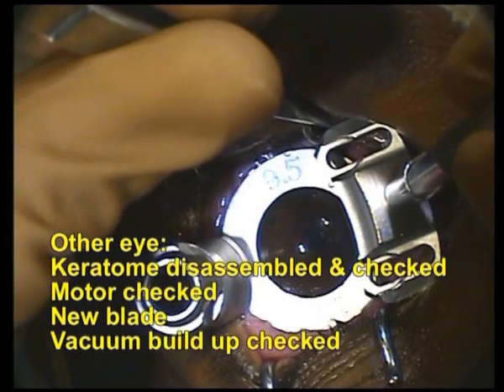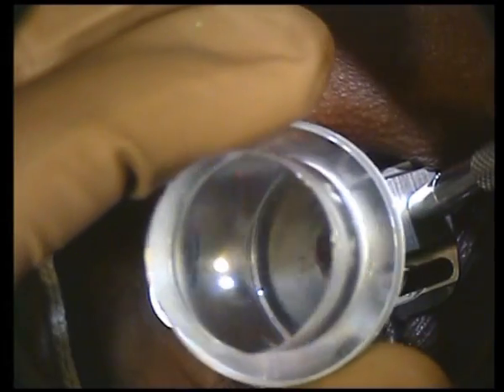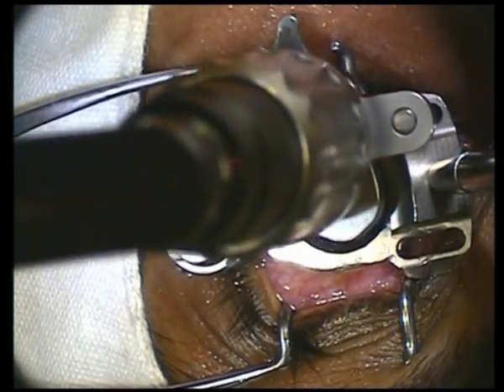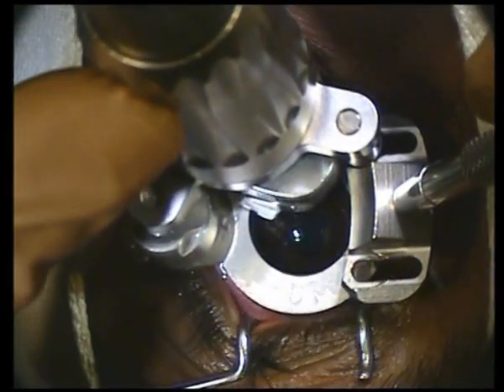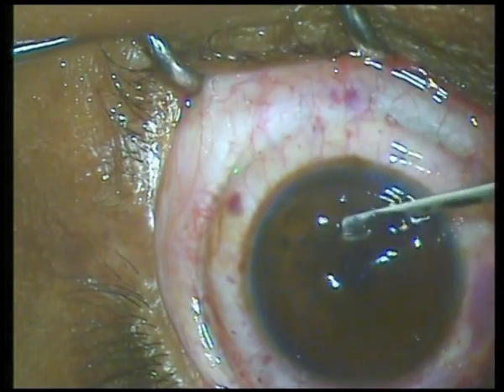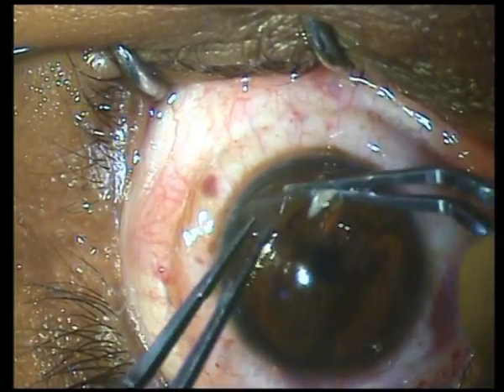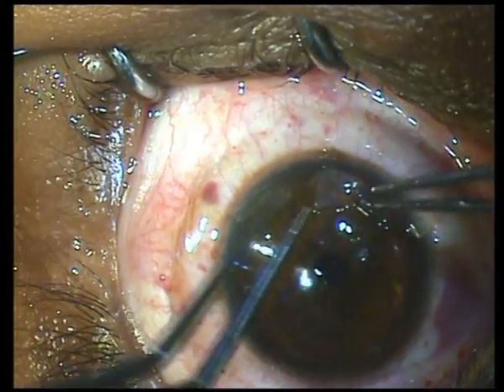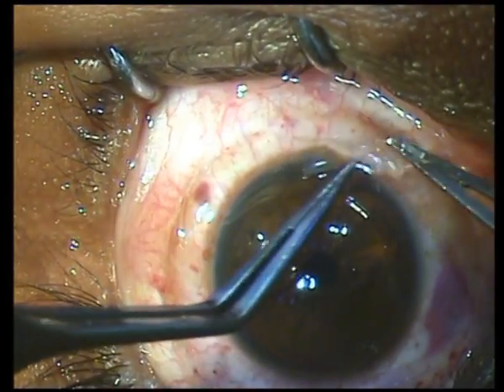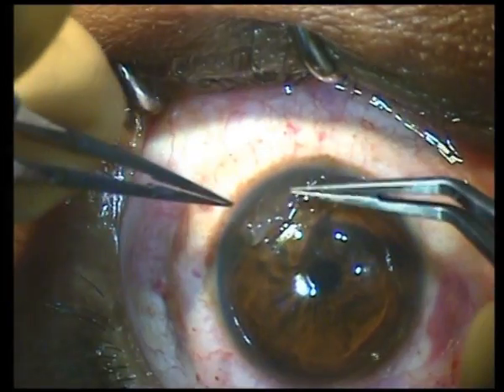The resident obviously not performing the surgery anymore. The microkeratome was placed and vacuum built up. IOP checked and the flap cut. A free cap? A frantic hunt for the flap revealed it in the site where a free cap is most often found, on the microkeratome head. A check of the free cap revealed that luckily it was intact, but surprisingly, it was a crescentic free cap.